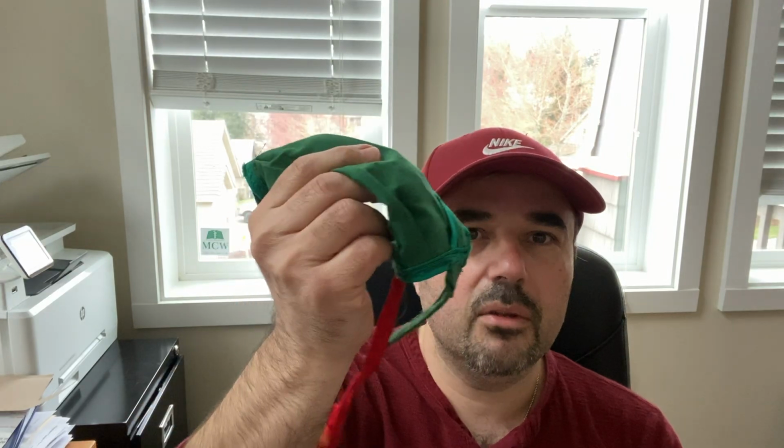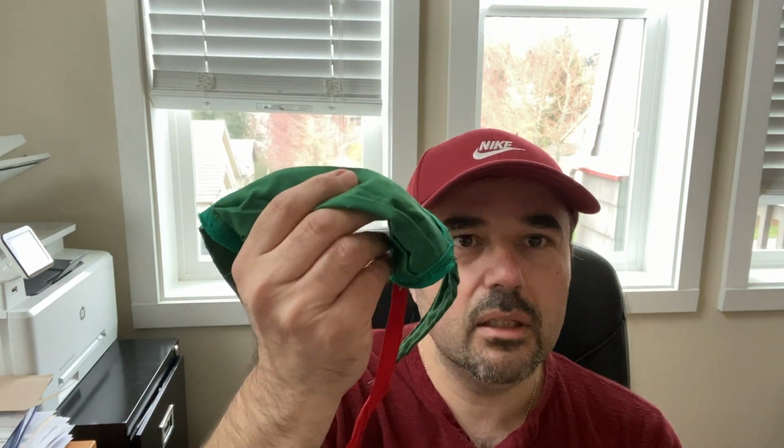All right. Well, I hope that was helpful. I'm going to have some additional videos about how you sanitize this and how you cycle them and wash them so that you can keep safe, and those are to follow. I also have a revised version of how to make the surgical mask a little bit easier without the pleats. It's not as pretty, but it'll do the trick.